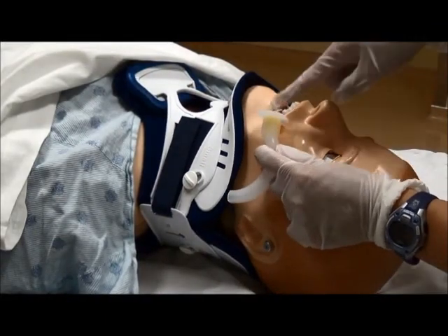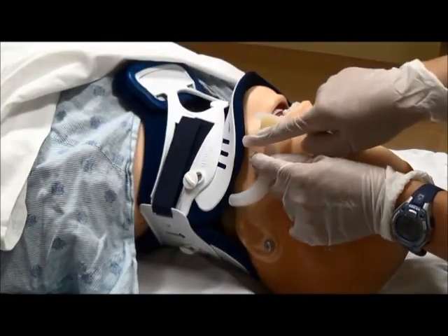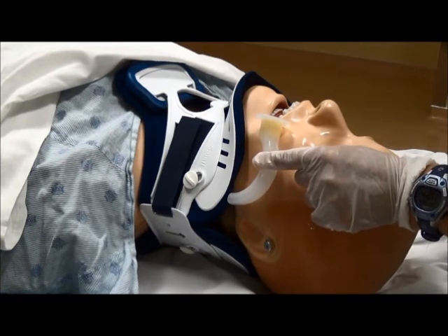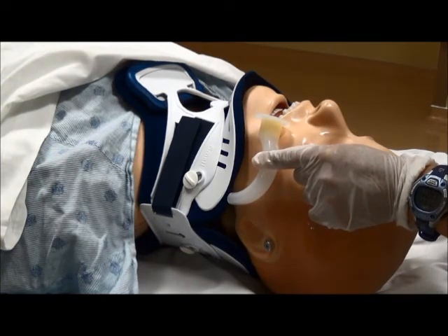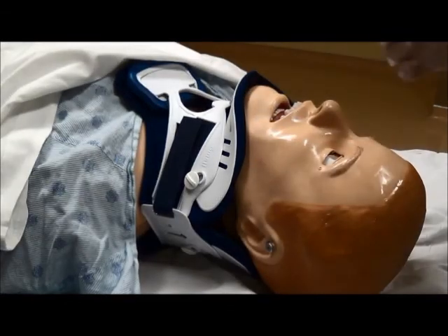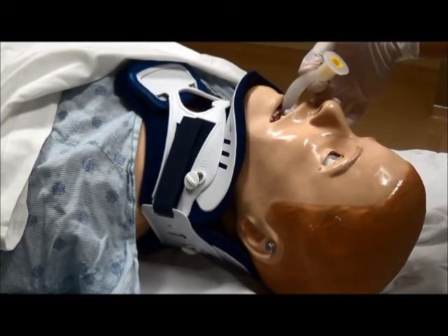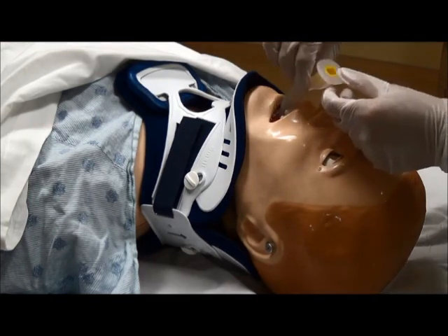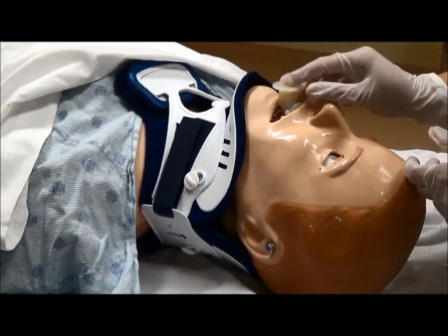To select the correct size, the length of the oral airway should be from the patient's mouth to the angle of the mandible. Insert it by pointing upwards into the patient's mouth to prevent it from hitting the tongue. Rotate it 180 degrees, then continue insertion.